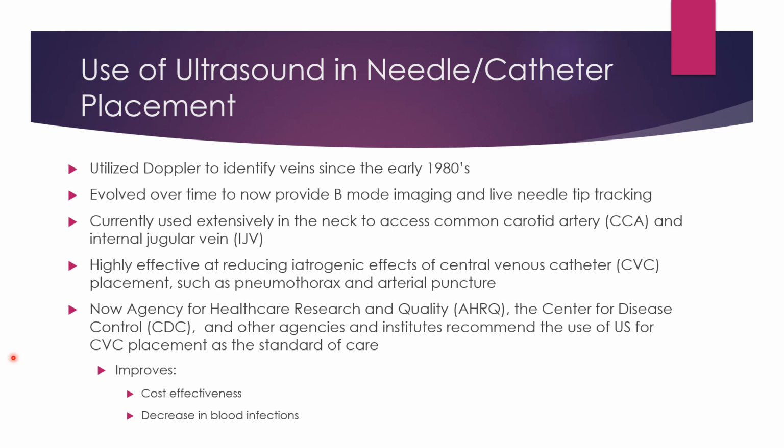So what they found was utilizing ultrasound in these catheter placements demonstrated a high effectiveness at reducing iatrogenic effects of CVC placement, such as pneumothorax and arterial puncture. So now there are certain agencies, the CDC being one of them, the AHRQ being another, that actually recommend the use of ultrasound for CVC placement as the standard of care, because they found that this improves cost effectiveness and decreases blood infections.